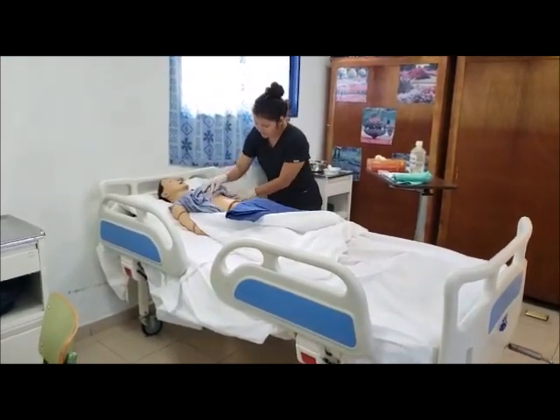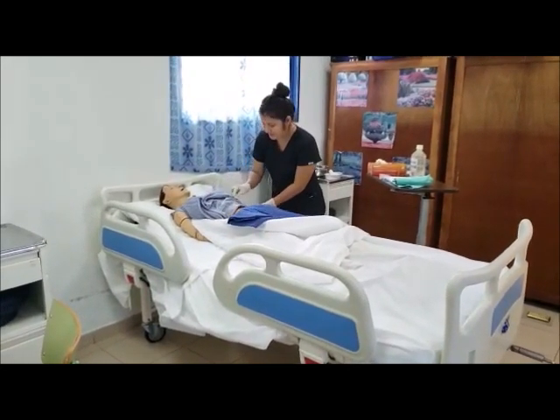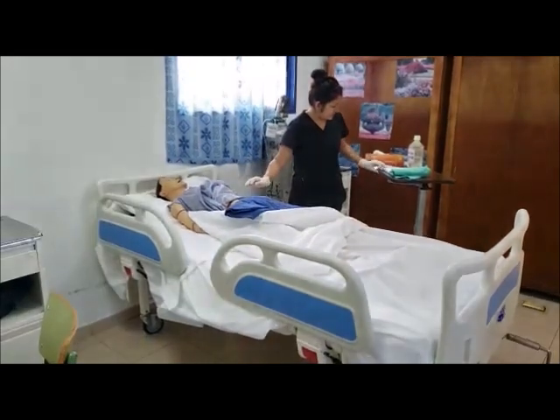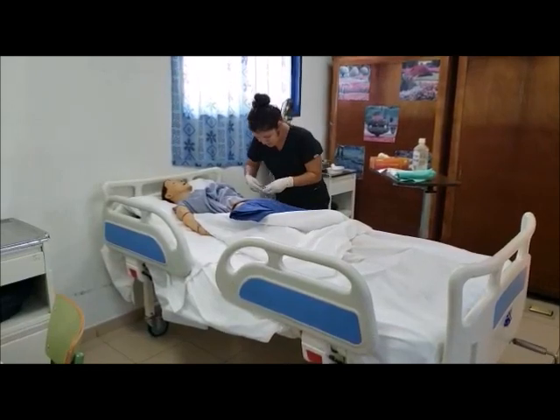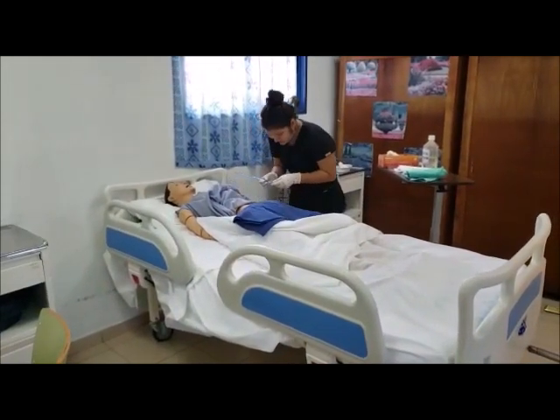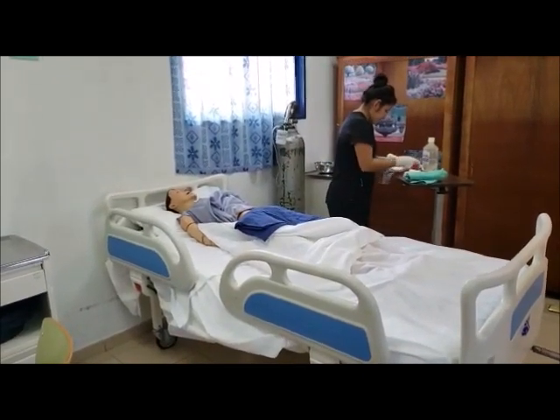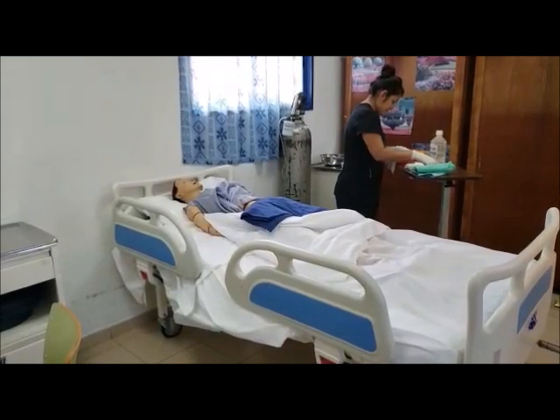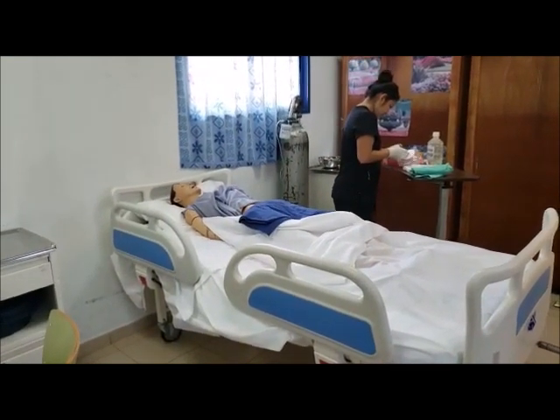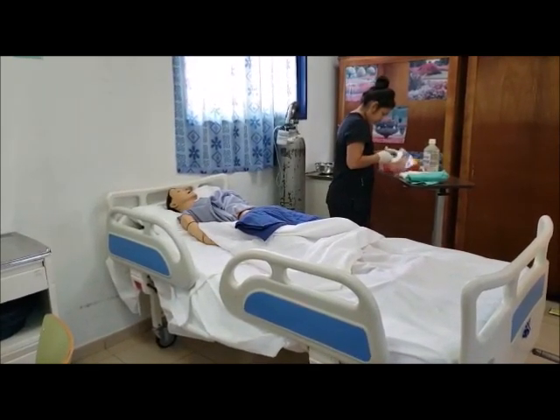We're checking your abdomen. Everything is good? Okay. Measure stoma at the base with a measuring guide. We're measuring your stoma. Alright. Trace measured pattern on pouch. Cut pouch to pattern, making sure opening is large enough, at least 1/4 inch, to encircle stoma without pushing on the edge.